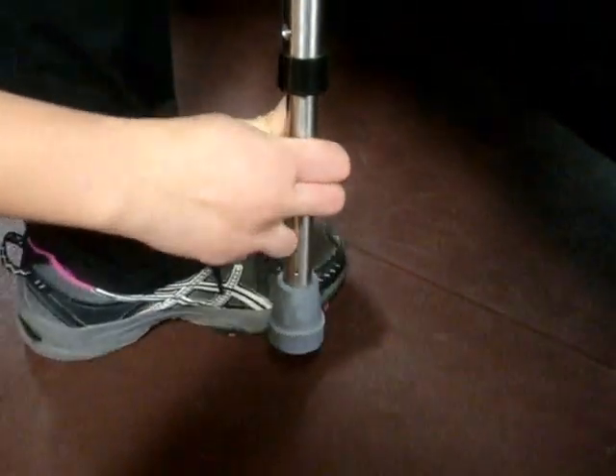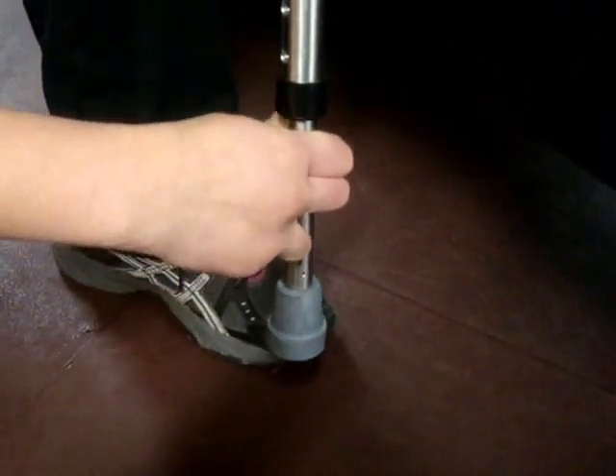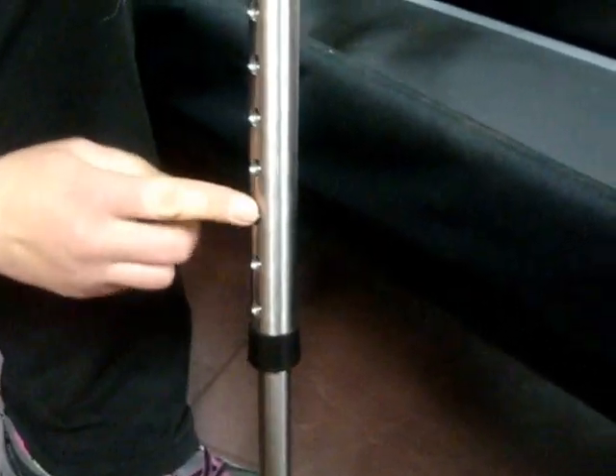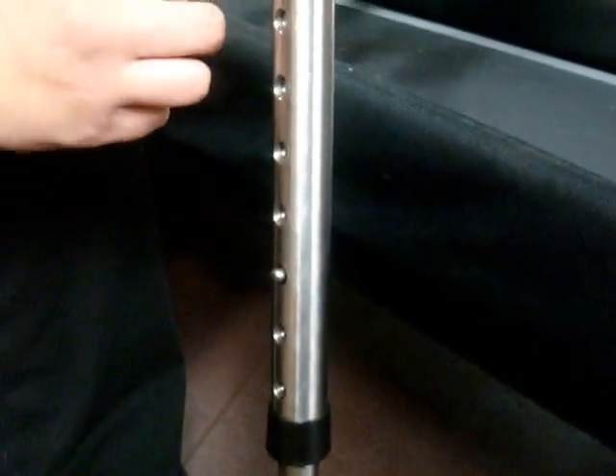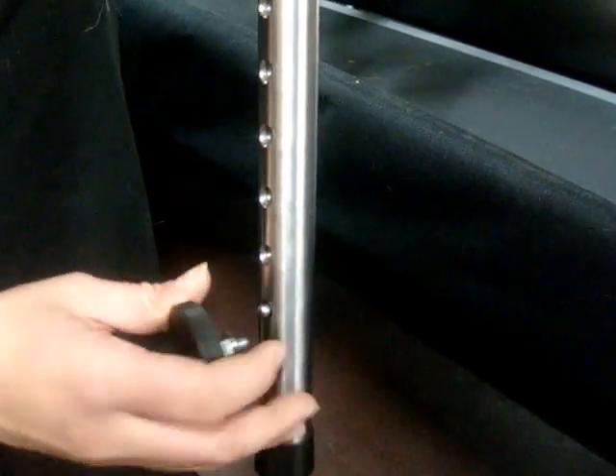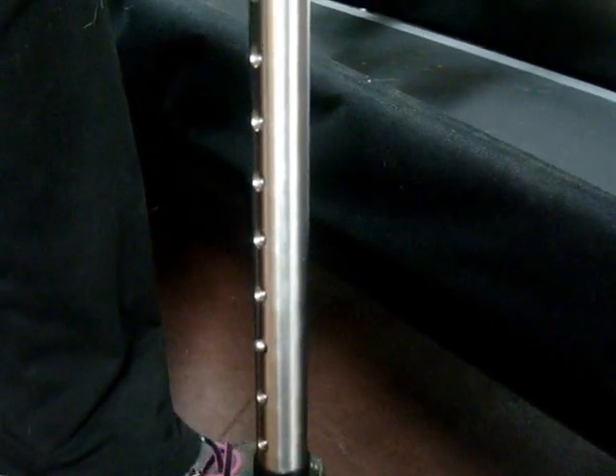You want to do about a 15-20 degree turn and move it up, and when we turn it back it's going to be up to the second hole. Each one of these holes is at one inch adjustments, so we can go up or down accordingly, and two inches is what we had measured to need.